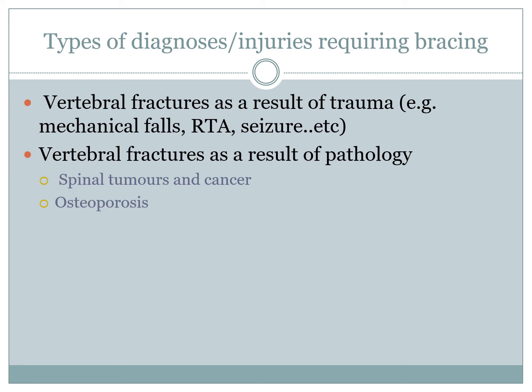The diagnoses which require spinal bracing include vertebrae fractures as a result of a trauma such as a fall or road traffic accident, and also a vertebrae fracture as a result of pathology, which includes spinal tumours or cancers and osteoporosis.